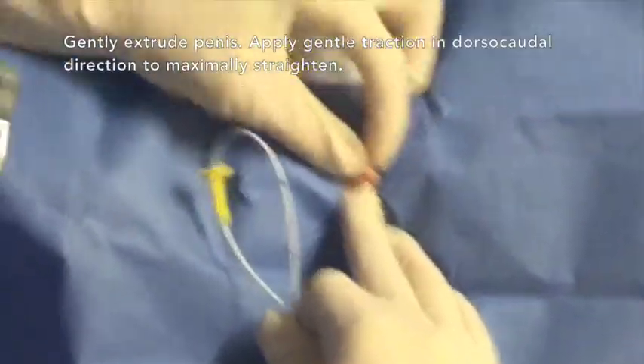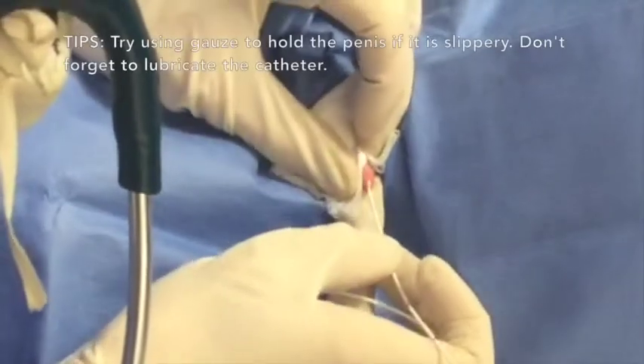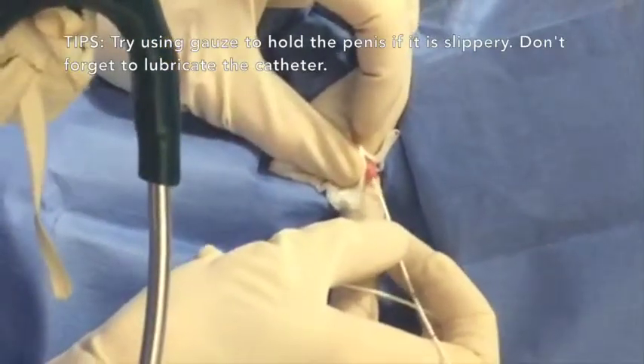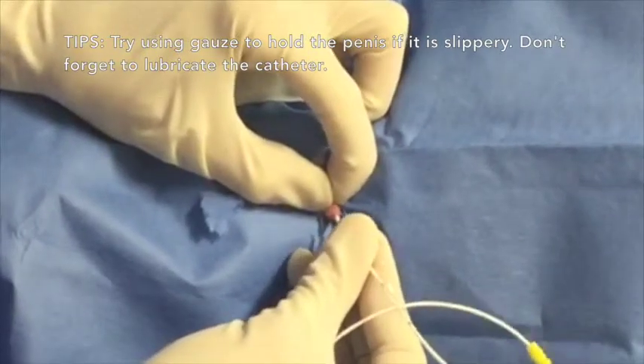Gently extrude the penis and dislodge any material that may be occluding the distal urethra. Handle these tissues as gently as possible. Begin introducing the catheter while maintaining the penis extruded.